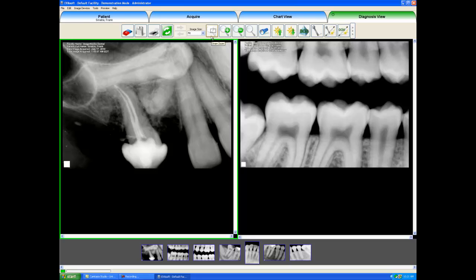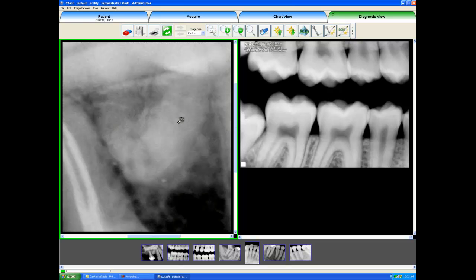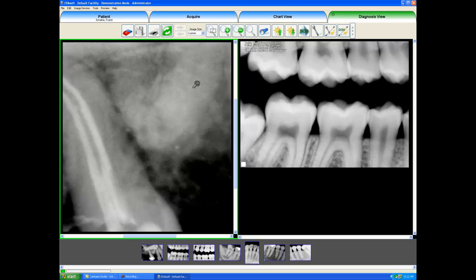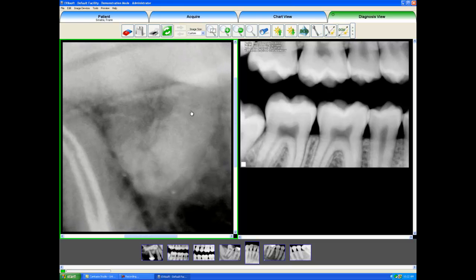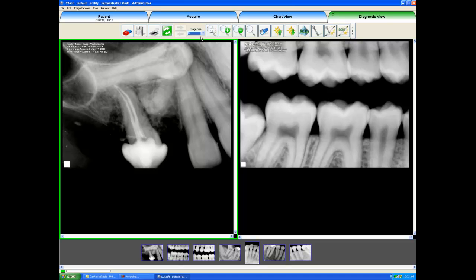We have a Draw Zoom button, where when I select this, I just click and drag the mouse over a region of interest that I would like to zoom in on, and I let go of the mouse and it zooms right in on that region. Like Google Maps, I could click and just move the image around should I want to look at another part. Now I want to bring the image size back, so I'll go to the Image Size drop-down menu and select Fit, and that will snap the image right to the proper size of the window so we can maximize our viewing of the image.